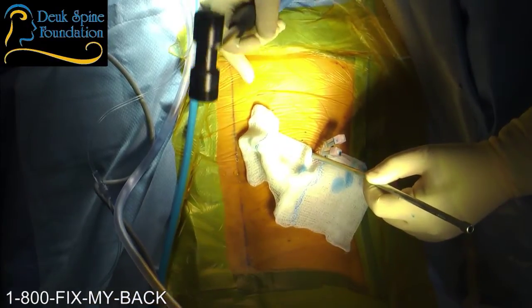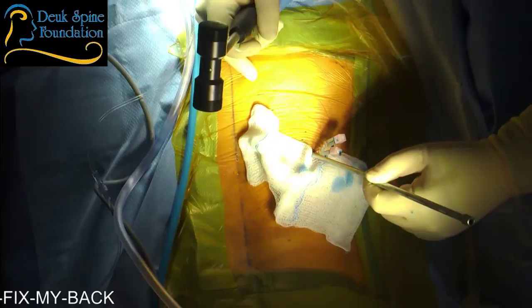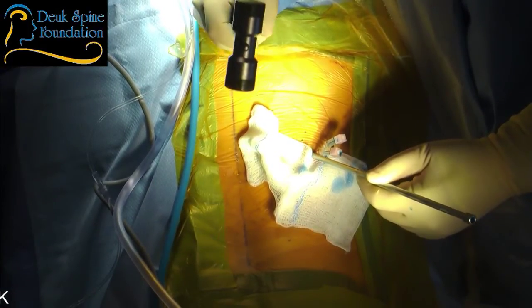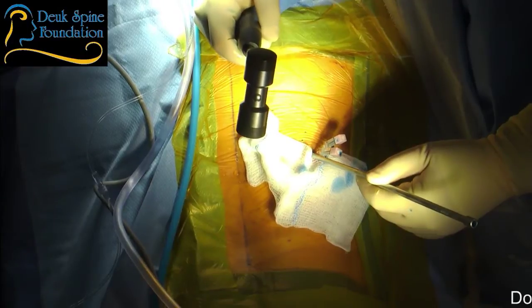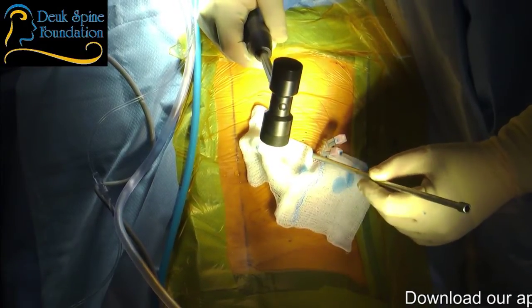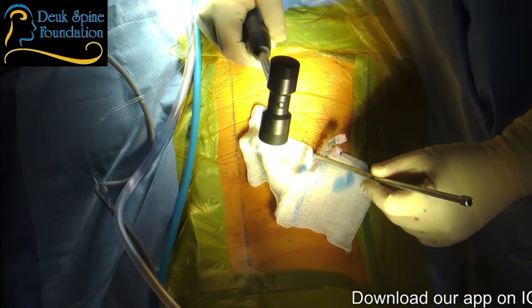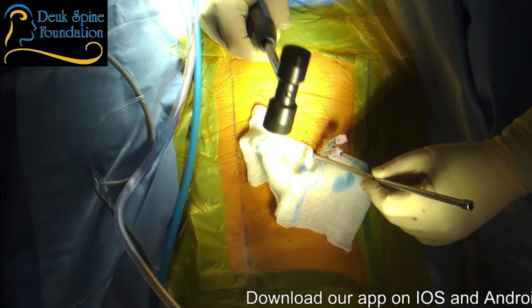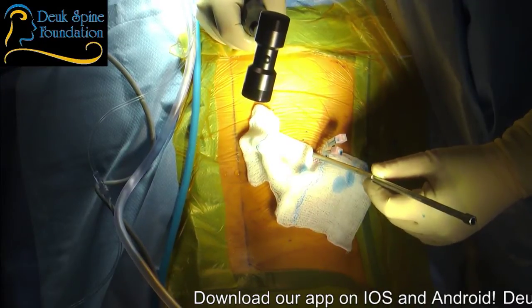Can you count from 1 to 100 out loud? Yeah. I mean, I know you haven't done a lot of these with me, but once you do a lot, you realize I do the same thing every single time. So get used to my sequence, and that way I don't have to stop talking to my audience. But once I do the discogram, as soon as I'm done with the last one, we're gonna put the patient to sleep.